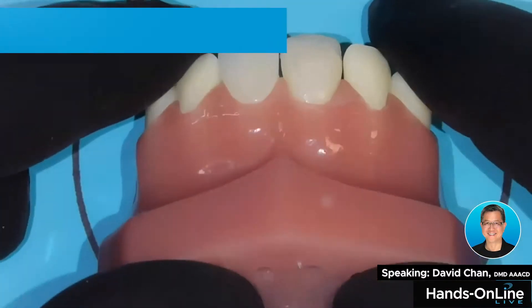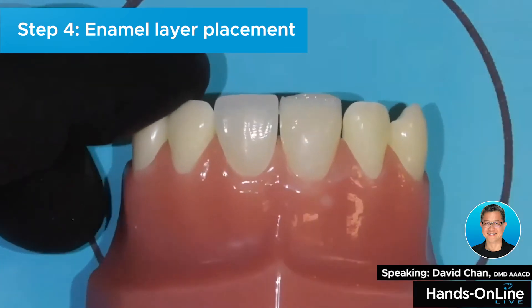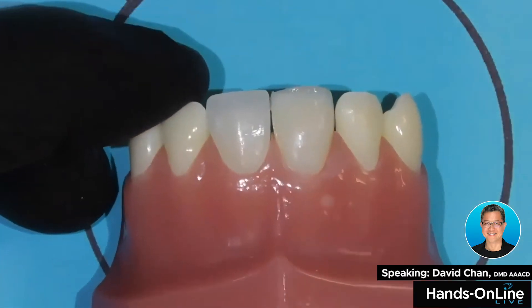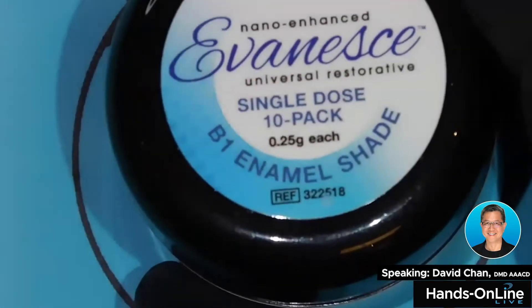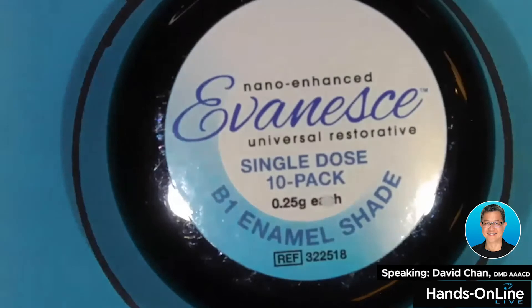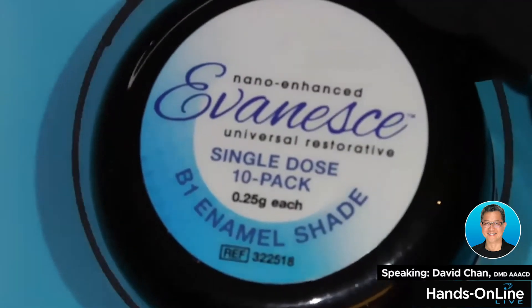So what I'm going to do next is add the final enamel layer, and I'm also going to be using the Evanes. This is B1 enamel, and this is 80% opaque. Remember, the dentin was 90%. I love it for its property because it masks fractures in class fours and matches dark teeth sometimes. Because enamel is more translucent, it's 80%.